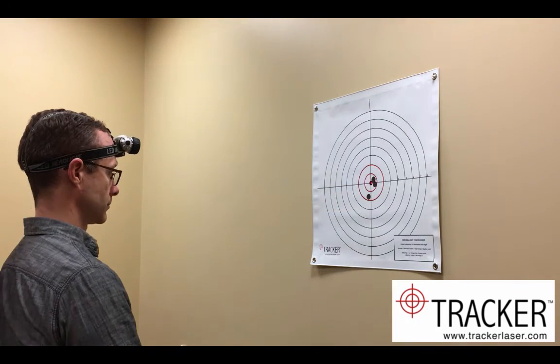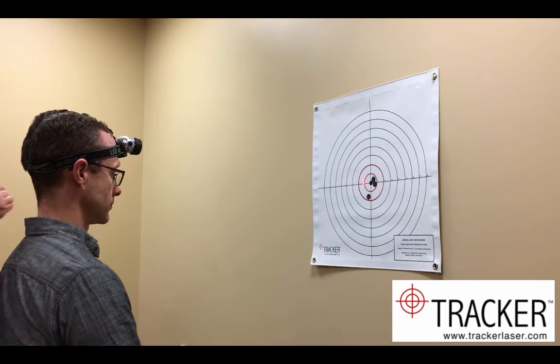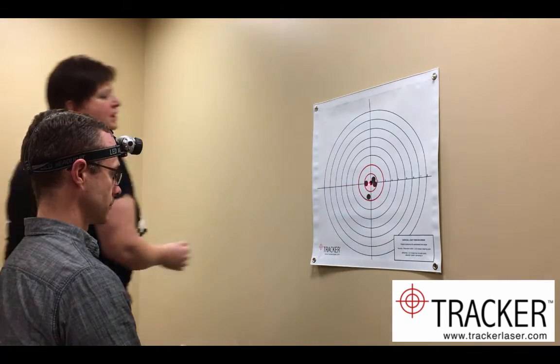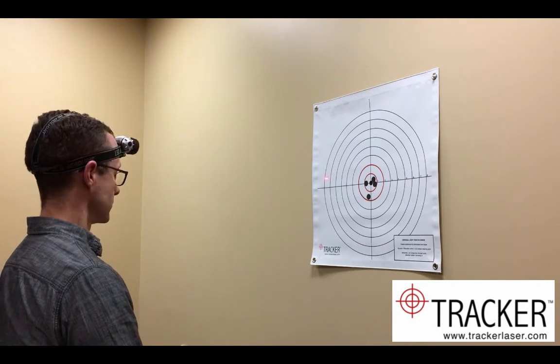Recenter, close your eyes, turn all the way to the left, and back. The patient continues this process, recentering between each trial.